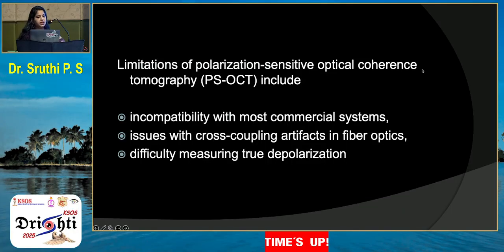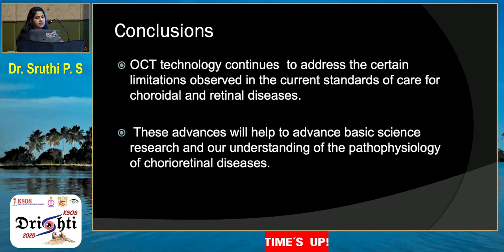The limitations are incompatibility with the commercially available systems, cross-coupling artifact in fiber optics, and difficulty in measuring true depolarization. Thus, to conclude, OCT technology continues to address certain limitations observed in the current standard of care for choroidal and retinal diseases, and these advancements will help in advancing the basic science research and our understanding of the pathophysiology of chorioretinal diseases.